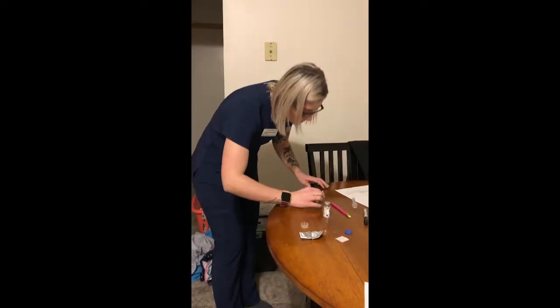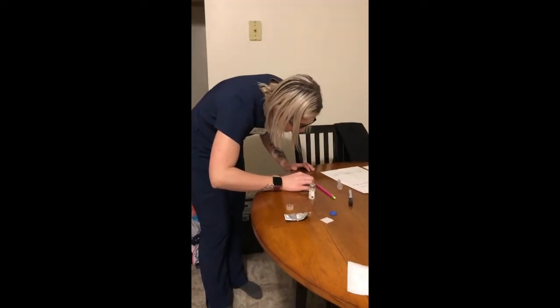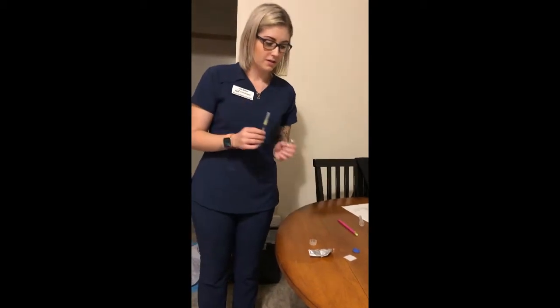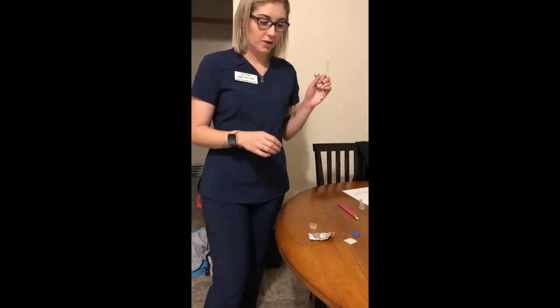And then to cap a sterile needle, you're going to scoop it and not have the needle touch anything. And then you can secure it at the hub. You only want to do this with a sterile needle when you're taking it into your patient's room. If this was a contaminated needle, you would either put it straight into the sharps, or if the sharps container is across the room, that's the only way that you can cap it and put it in the sharps container. So I'm going to take this and my vial into the patient's room.